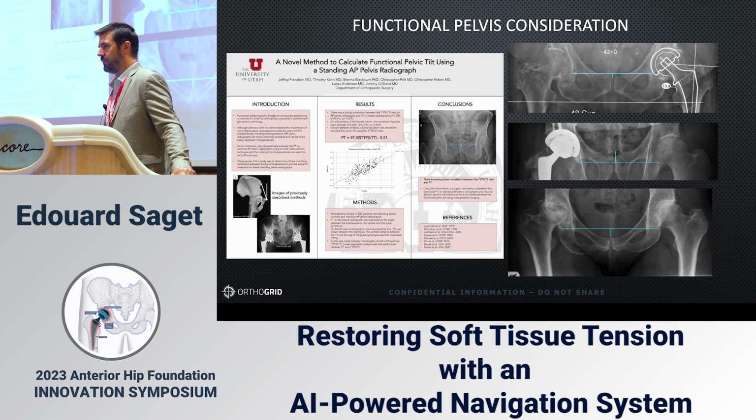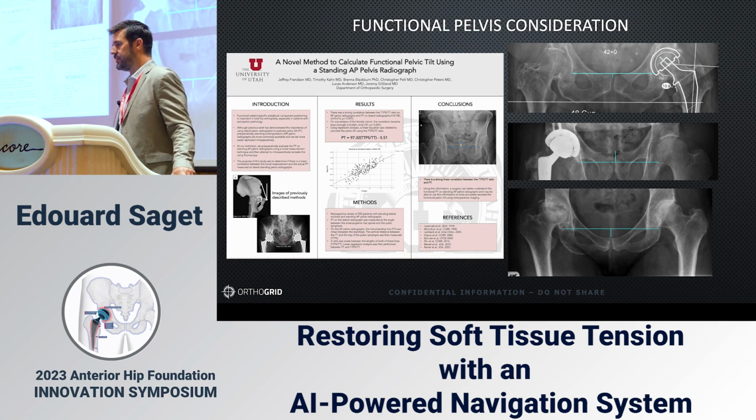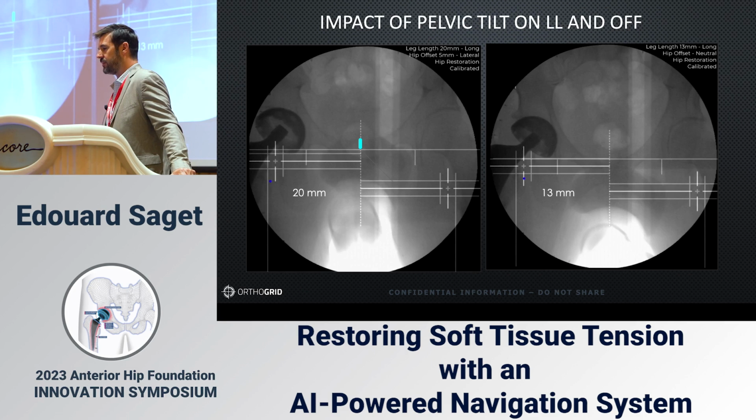Related to the functional pelvis consideration, as reproducing that patient pelvis, we saw they're all different. Dr. Gilliland, again, really likes fluoroscopy, studying the top of the symphysis pubis to the trans-teardrop line, a relationship that's easy to reproduce with your C-arm. As you can see here, these different patients have different standing and functional pelvis positions, so this is a very easy way to double check things. And it does have an impact on how you measure things.